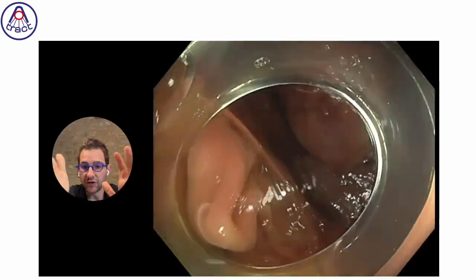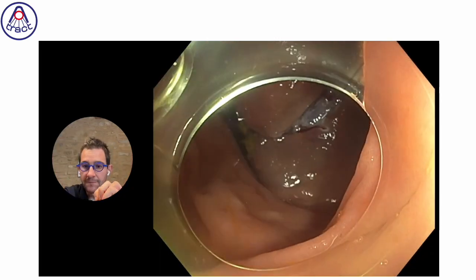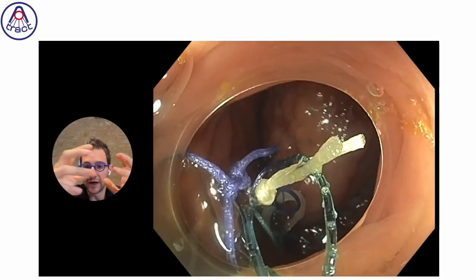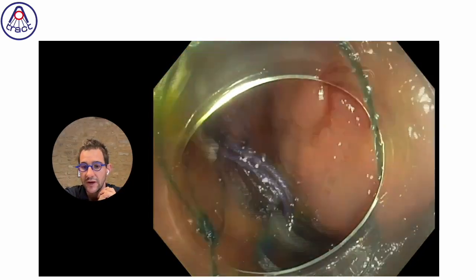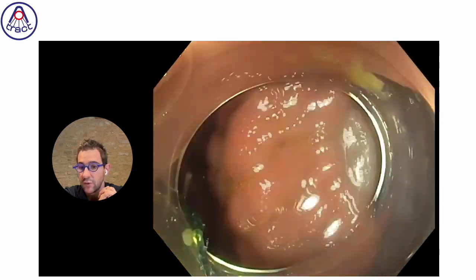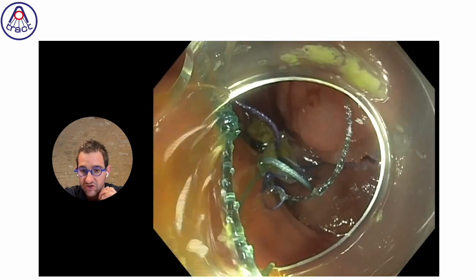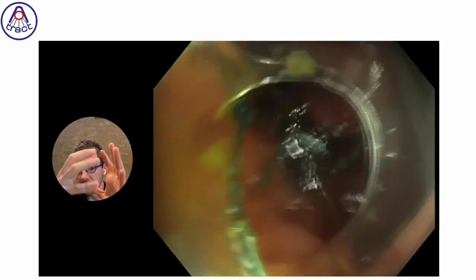But if I do it without any traction, finally I will lose time, because I will go really faster thanks to the traction. It will stretch all the fibers, and every knife cut will cut more fibers with traction than if I do it without any traction. So here it was easier to catch the anal edge loop, not the fixed point, but the anal edge.